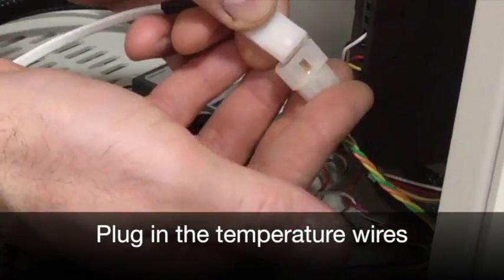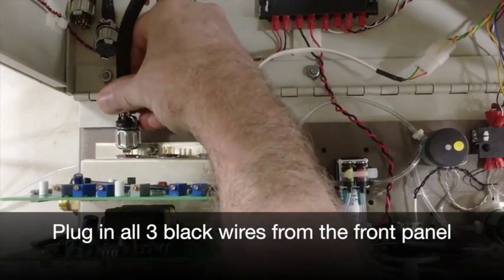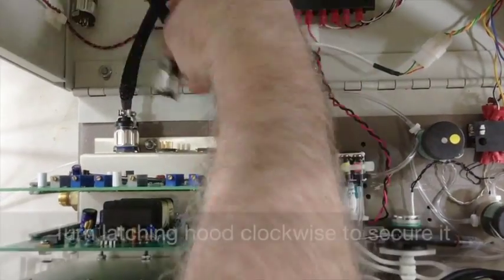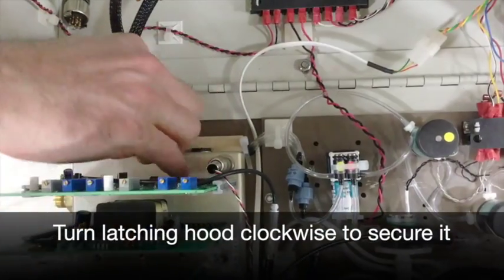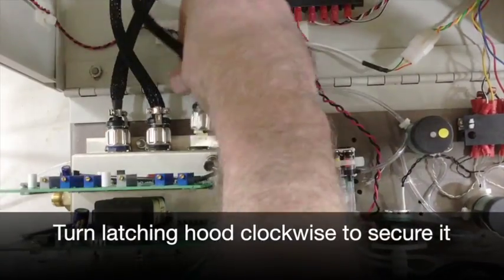Plug in your temperature wires. Plug in the 3 black wires that come from the front panel into your bottom panel. Make sure that you line up the pins with the correct plug and socket. Also, use the latching hood and turn it clockwise to lock it in place.